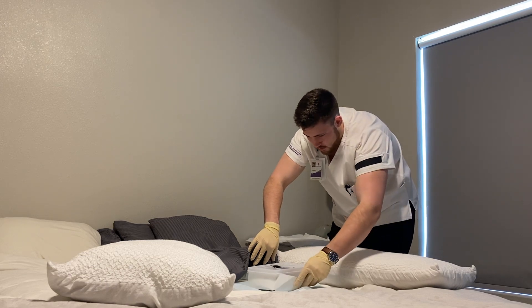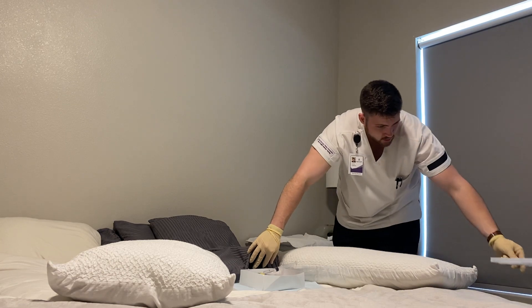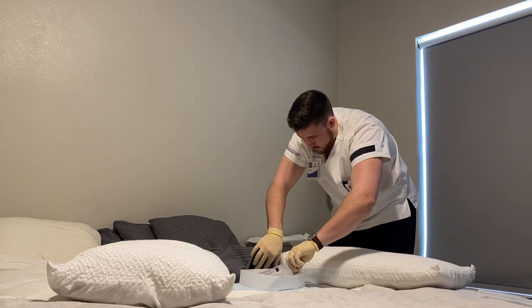We can now remove this top part of the box. Come around the patient and drop that or bring it out of the sterility range. And I will dip the end of the catheter in lubricant.